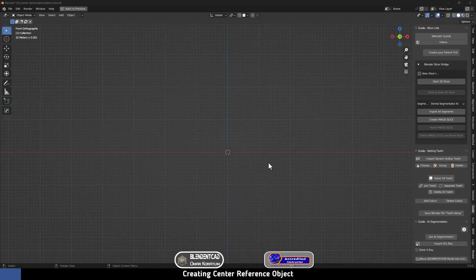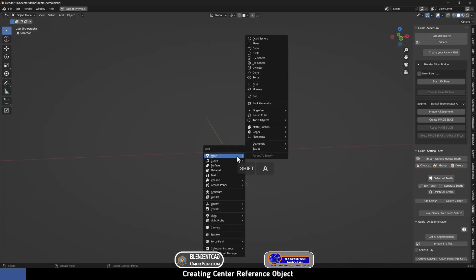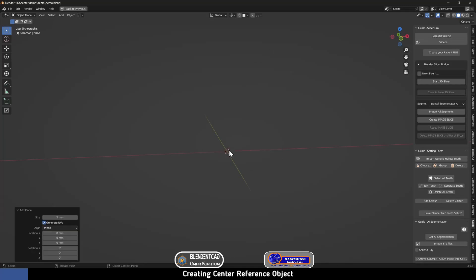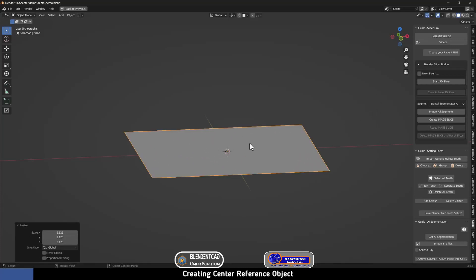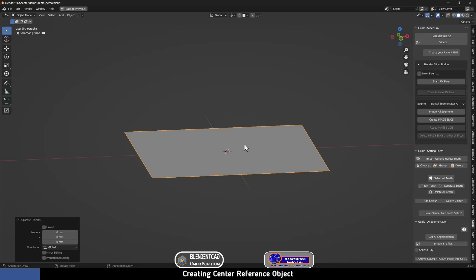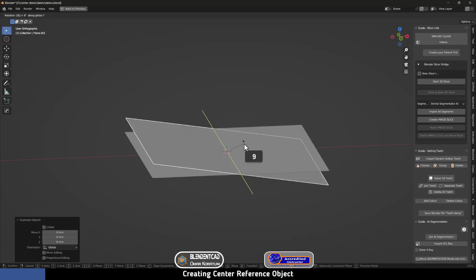The object that you are going to use as a reference can be anything, but what I like to do is add a plane. I'm going to press Shift+A, Mesh, then Plane. I'm going to scale it by pressing S and make it big enough. Then I'm going to make a duplicate by pressing Shift+D and right-click to leave it in place. Then I'm going to rotate it in the Y-axis by 90 degrees by pressing R, Y, and typing 90 degrees.